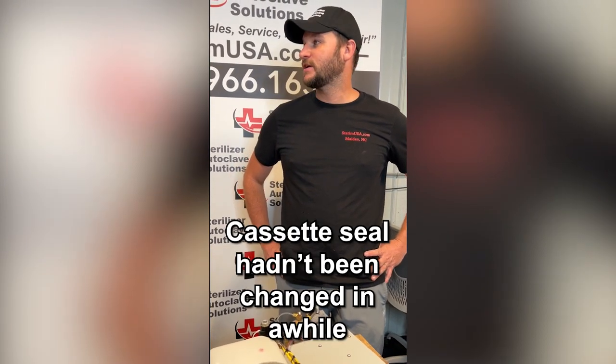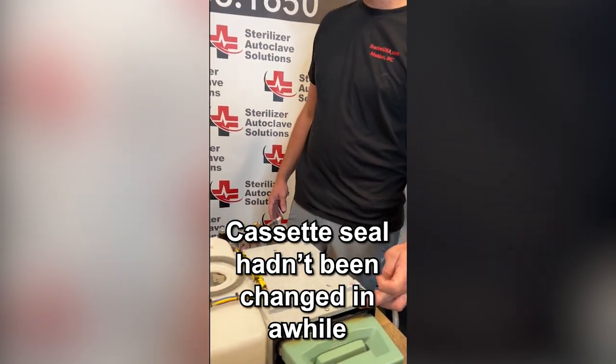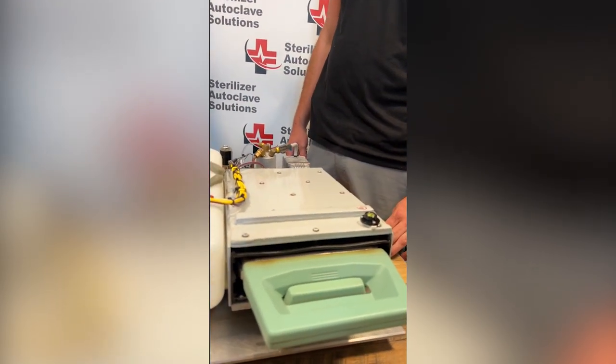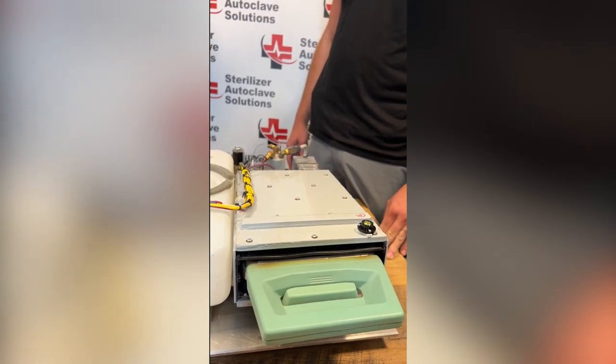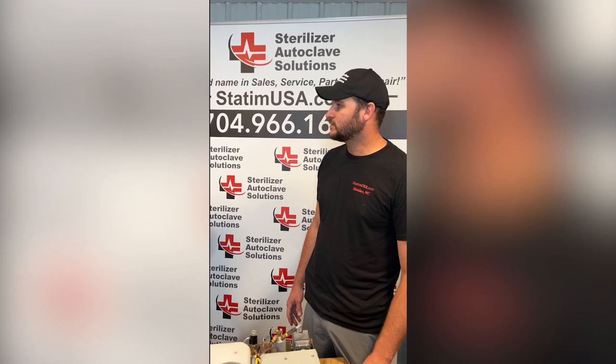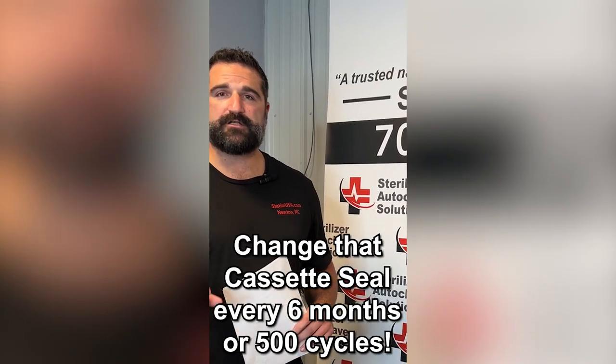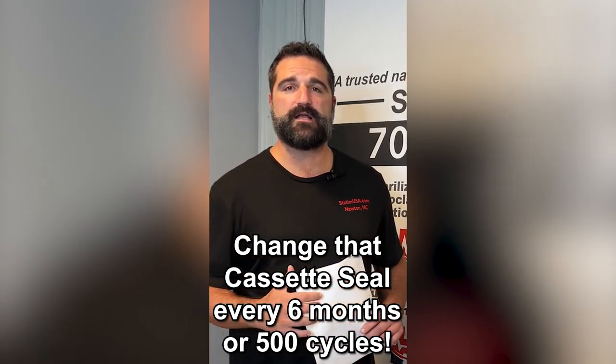I asked them when the last time the cassette seal was changed, and it had been a while. They were getting heavy steam coming from the front. As far as a cassette seal goes, the manufacturer recommendation is every six months or 500 cycles. So for those of you at home, that cassette seal needs to be changed every six months or 500 cycles.